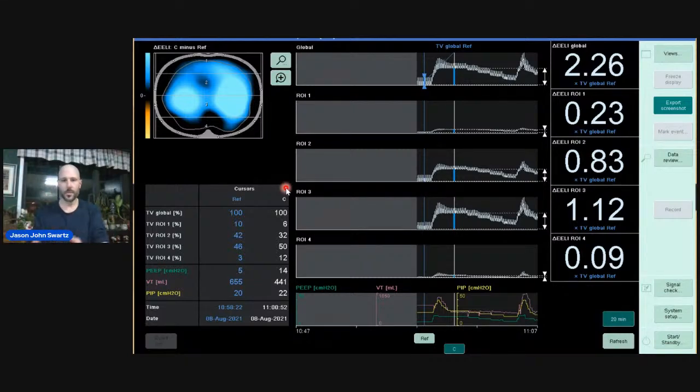I'm gaining volume. You can see right away the trending of these impedance values. You can see the angles. Your eye catches that right away. And then you got the color coded one. And then you do a little bit of math and you got the tidal volumes.